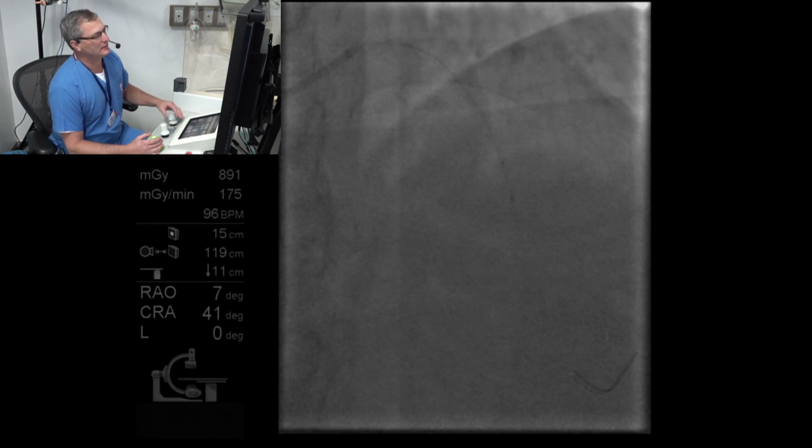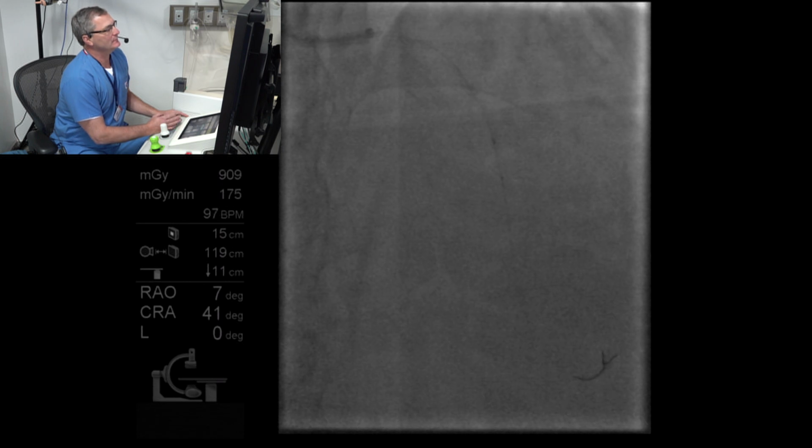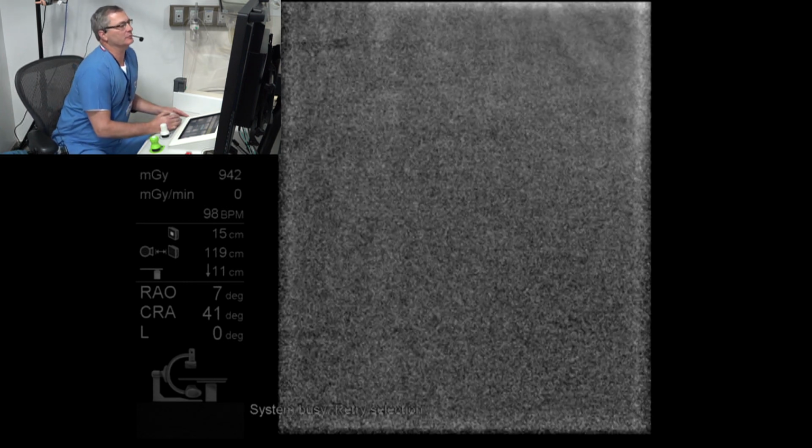Again, guide sucking in, push on the balloon, pull the guide backwards, then pull the balloon back, and go up there, please. Eight, 10, 12. Down. Okay, I'm going to take the balloon back and take a picture and see what we've got going on here.